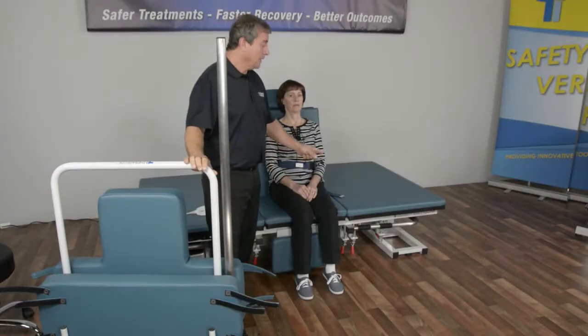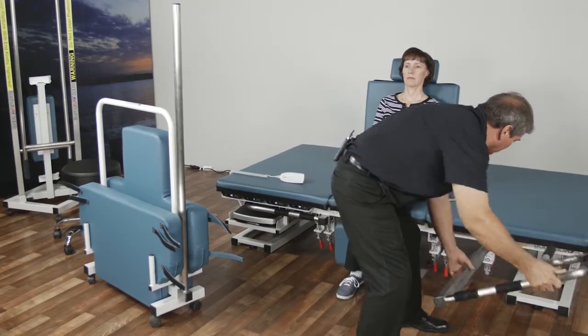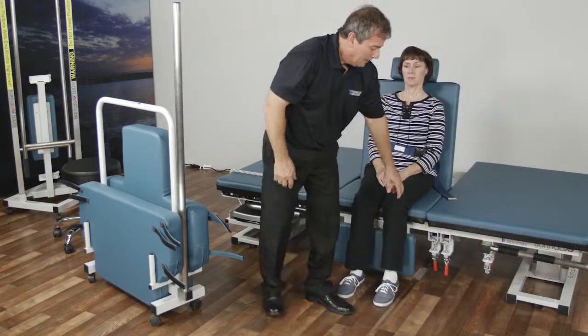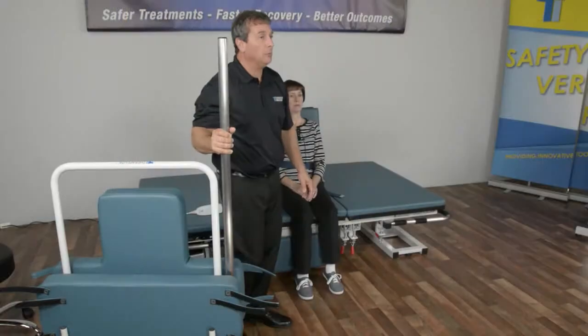First of all we're going to remove one of the transfer bars. That way now we have the two options of the receiver bars to put the standing pole.